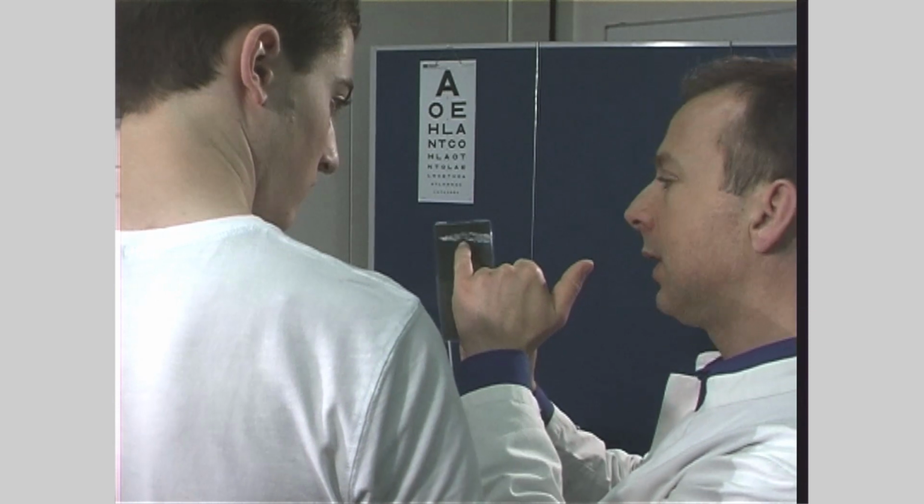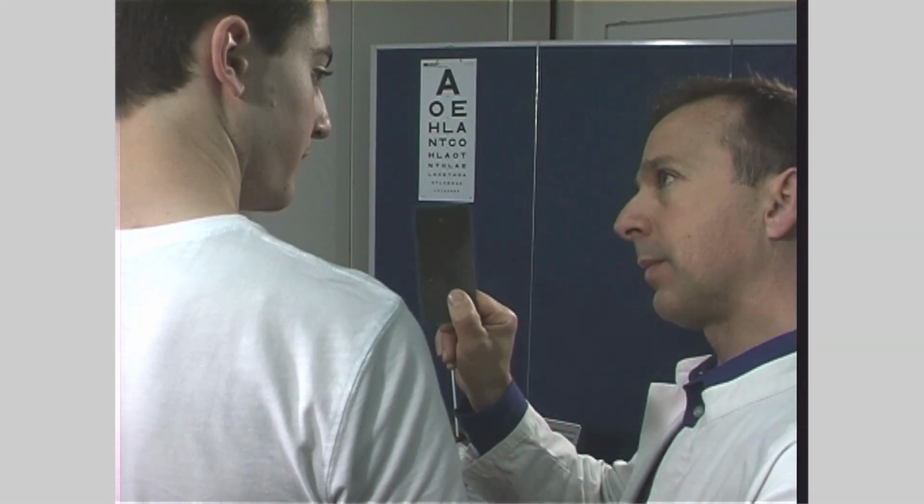To confirm that poor visual acuity is due to a refractive error, you can ask the patient to look through a card with a pinhole to see if this improves focusing. And look at the smallest print and tell me if it appears different.